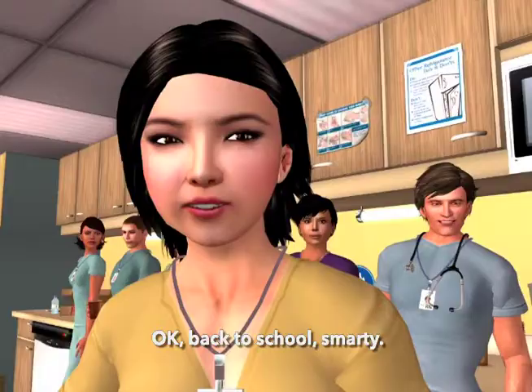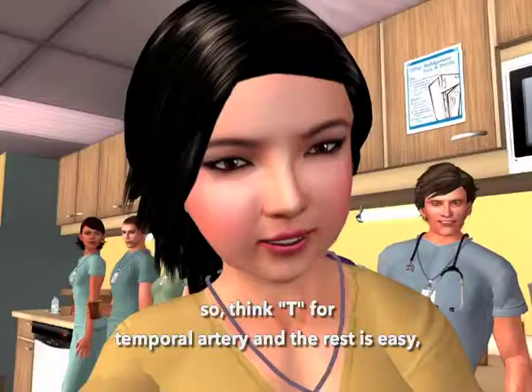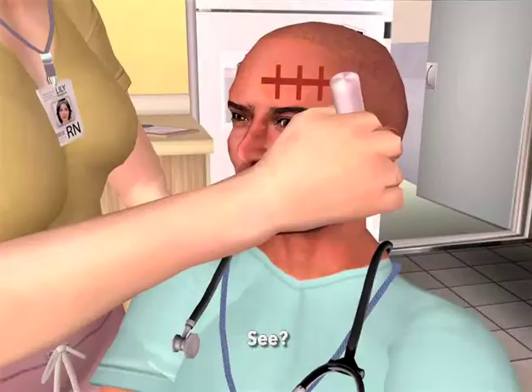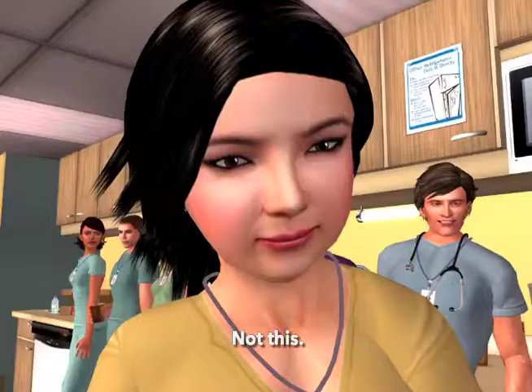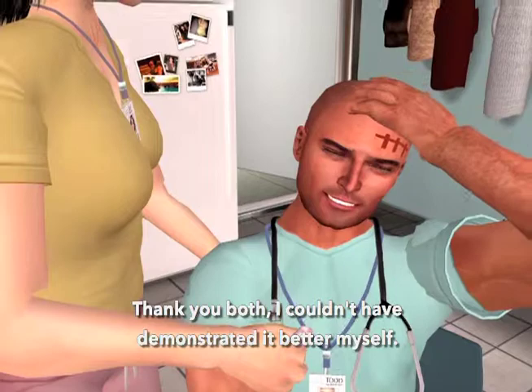The superficial temporal artery is up in the forehead, but varies in exact location from person to person. We need to cross the artery, so think T for temporal artery, and the rest is easy — just cross the T's. It certainly looks like we have our patient and our nurse educator. Thank you both. I couldn't have demonstrated it better myself.